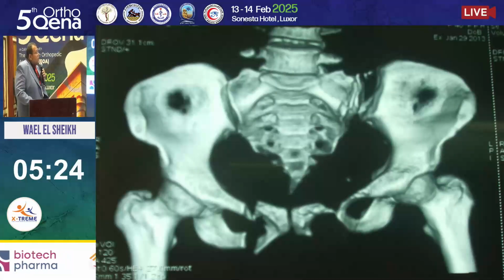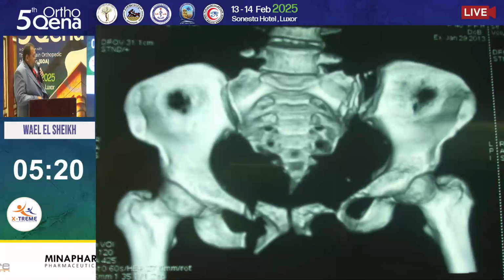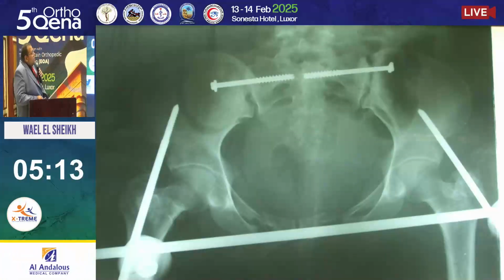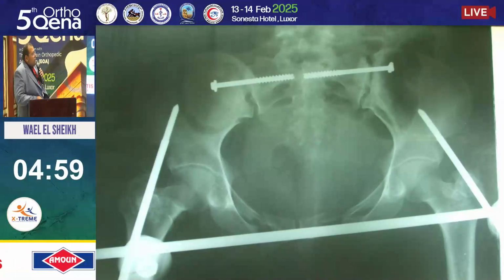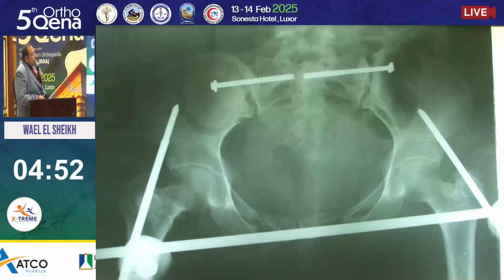In such a case, it is a bilateral pelvic fracture type C, with severe disruption of the anterior bony ring. We did bilateral sacroiliac screws and external fixation. We removed the external fixator at 2 months. Fusion occurred posteriorly, and the posterior ring is good. But unfortunately, the anterior ring went to non-union, and the patient suffered from chronic bilateral inguinal pain.